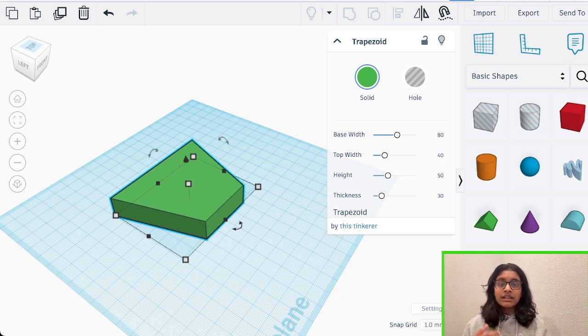And if you want to add any landscaping with cylinders or spheres or the scribble tool to add any curves, feel free to, because that's how your natural hand generally looks. But for the simplicity of this project, we'll be leaving that out.